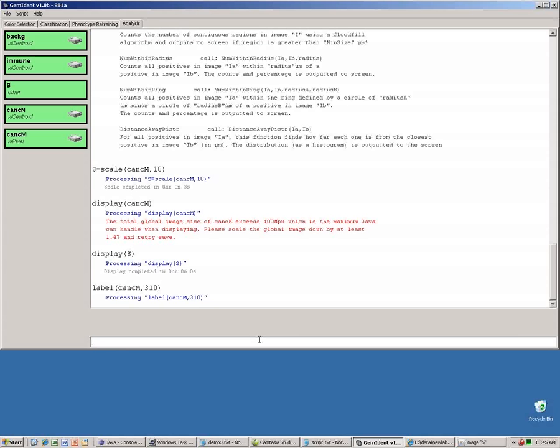Notice that the analysis page is fully parallelized. There is no limit to the number of commands that can be executed simultaneously, and all available CPU cores will be used. Compare this to other languages such as R and MATLAB, which take single commands in series and only use one processor.